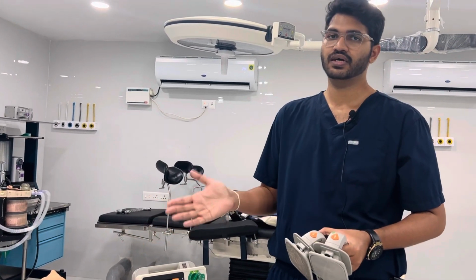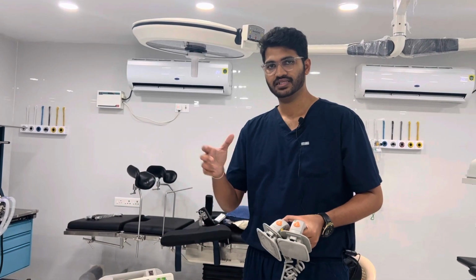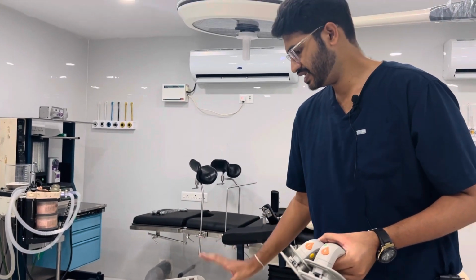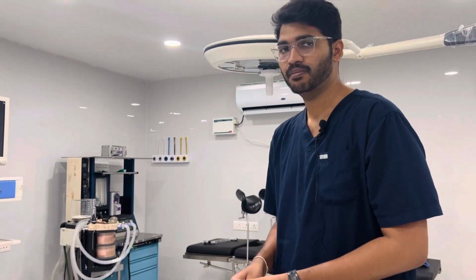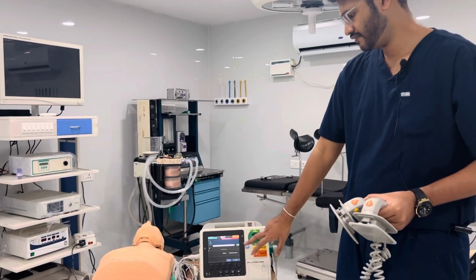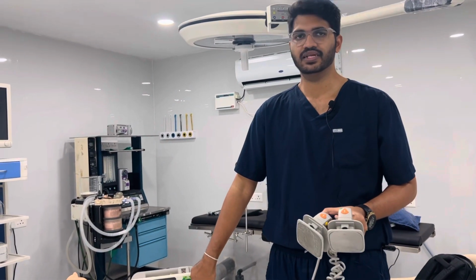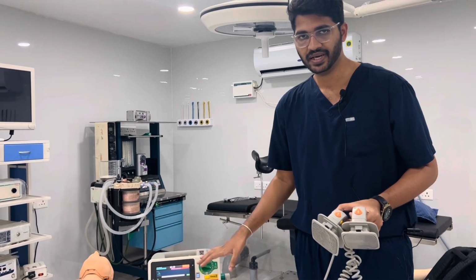Coming back to cardioversion, when you find the patient has SVT or AF, as I said before, you have to set a particular joules. For example, if I set 50 joules, the energy delivered will be around 50 joules. But before delivering the shock, you have to press the sync button, wait for some time, and then deliver the shock. Pressing the sync button delivers the shock at the peak of R. That is the concept behind the sync button.